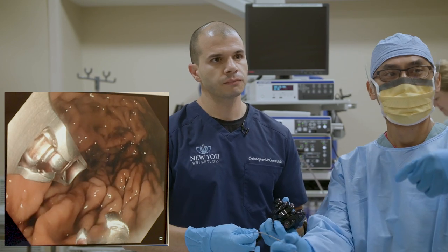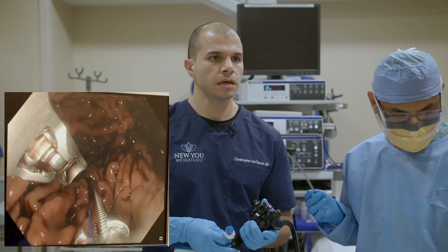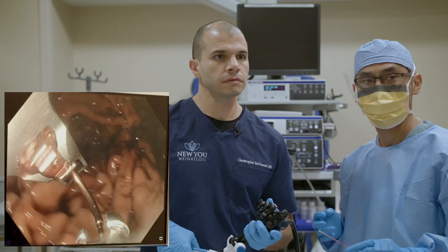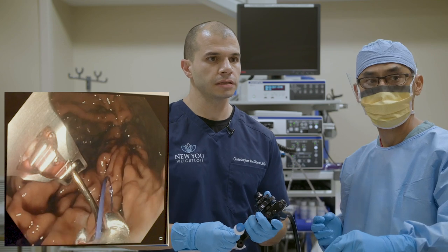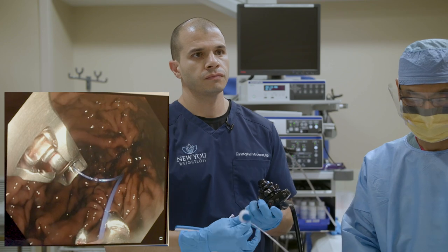We're nearly complete here — probably less than 10 minutes. We're going to start turning down our sedation so our patient will wake up nice and fast afterwards.